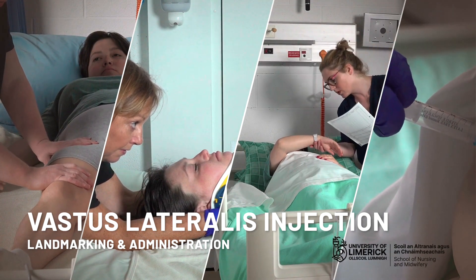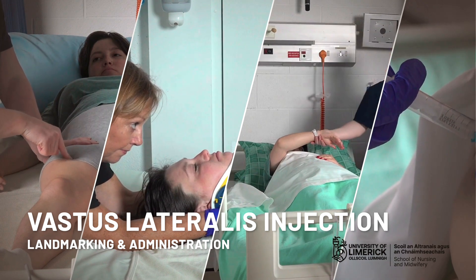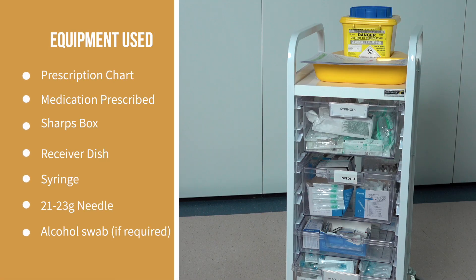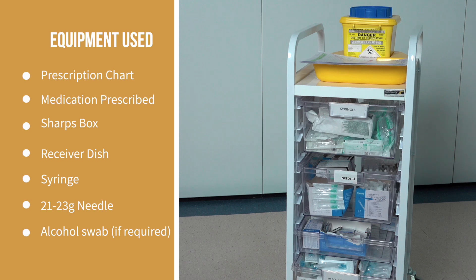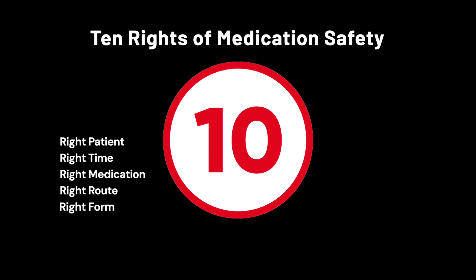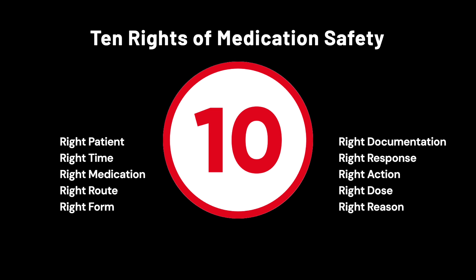In this recording, the following clinical skill will be demonstrated. Equipment for this drug administration has been pre-prepared using aseptic non-touch technique. Before administering a medication, remember the 10 rights of medication management.